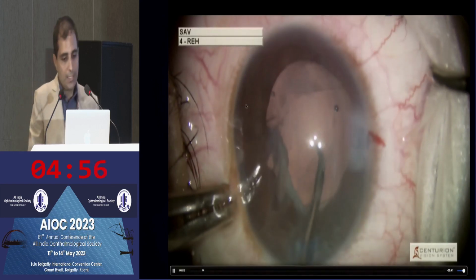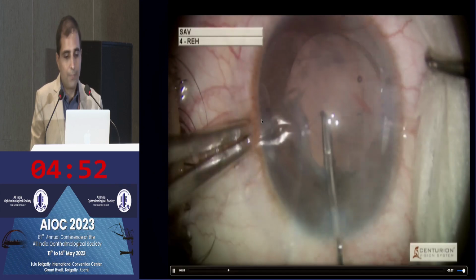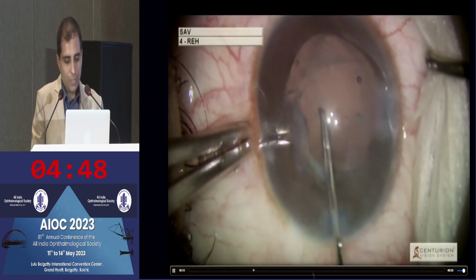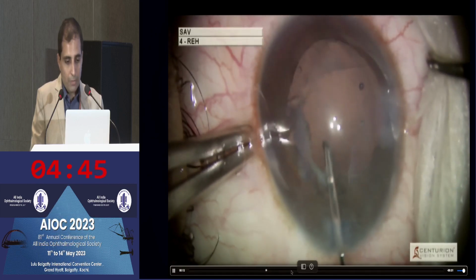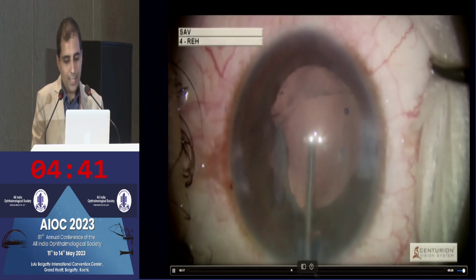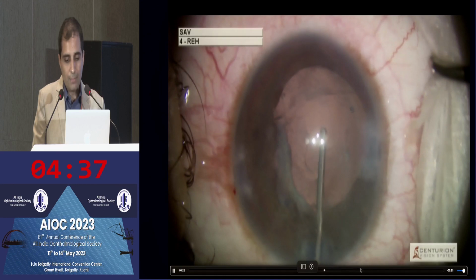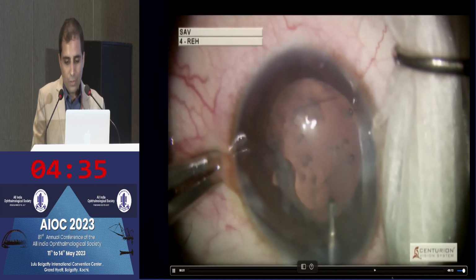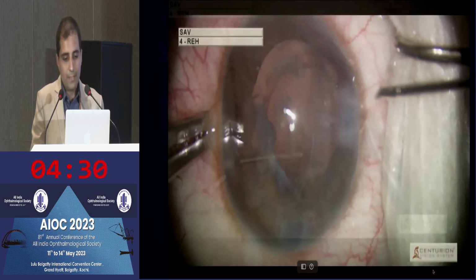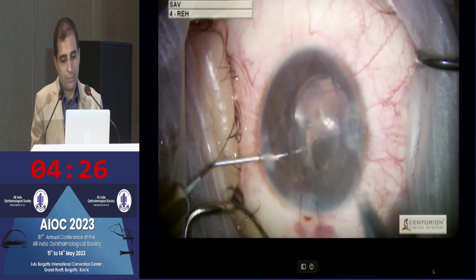Again, once the lens removal was done, fortunately the posterior capsule was intact, and we are going ahead by creating an opening in the posterior capsule, using micro incision rhexis forceps and going from one side port to the other. And these are the eyes where you do need a good cohesive viscoelastic. Healon GV is our preference in such eyes. And slowly but surely we are able to create this into a reasonably large posterior capsulorhexis, and we went ahead with an optic capture of the 3-piece IOL.